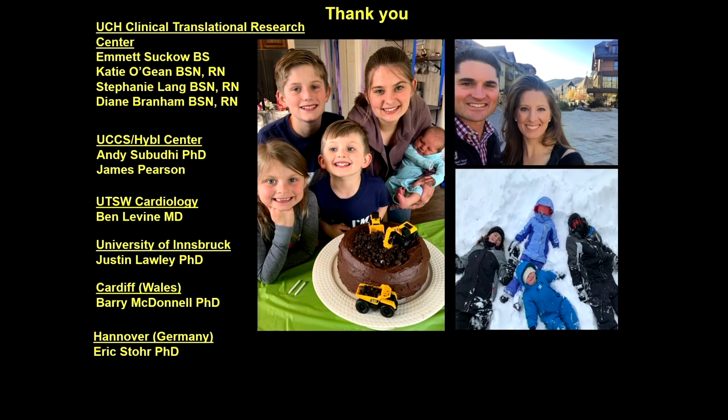So as far as the second question, on volume calibration, I don't remember who made this comment once, that when calibrating catheters, it's not the catheter that needs calibrated, it's your expectations that need to be calibrated appropriately. And I think that's a great way to summarize my experience with these things. There are 3 ways to calibrate them. You can get a volume assessment by MRI, you can get a volume assessment by echo, or you can use hypertonic saline. There are pros and cons with all of these.